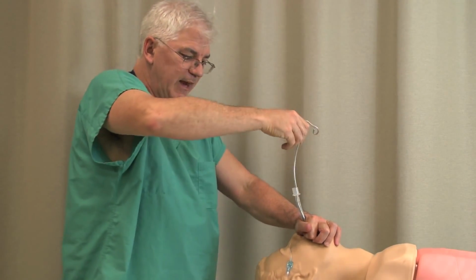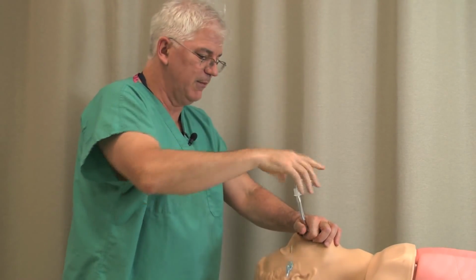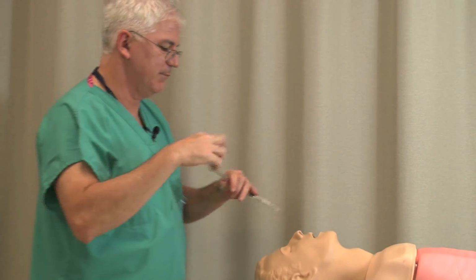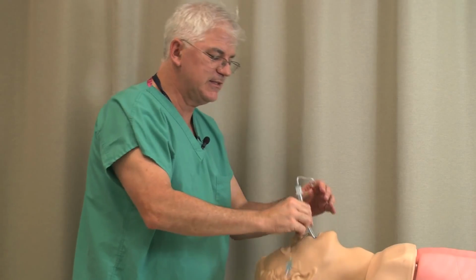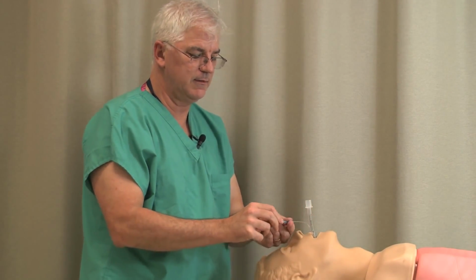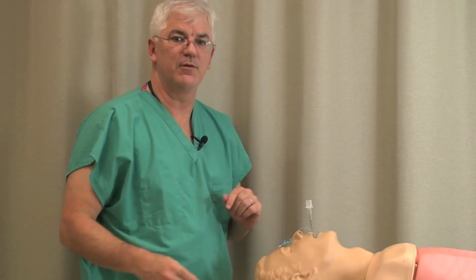When you pull that stylet out, make sure you hold on to it. Again, I've seen everything in my day, but I've seen people pull the whole thing out when they're pulling out the stylet, and you don't want that to happen. So now, let's say this thing is in, pull the stylet out, then you're going to inflate the pilot balloon and make sure that you're in the right place.